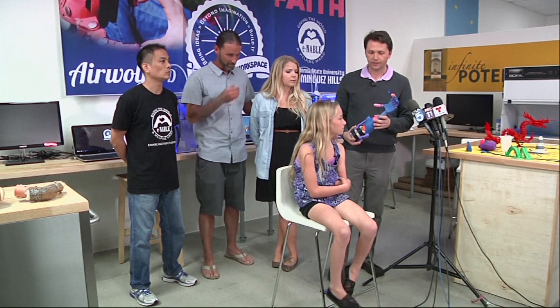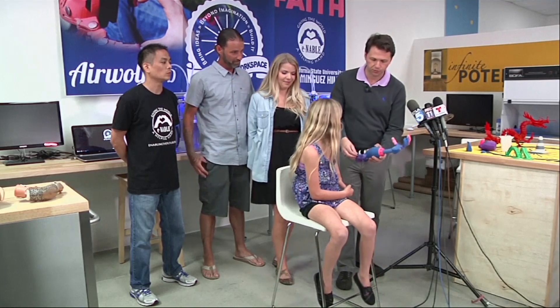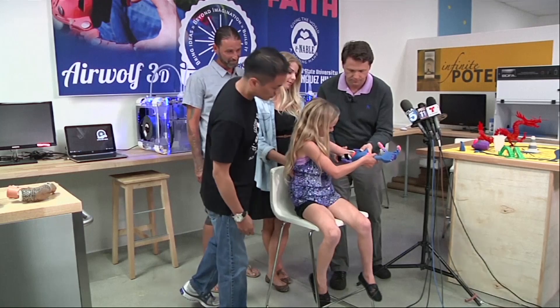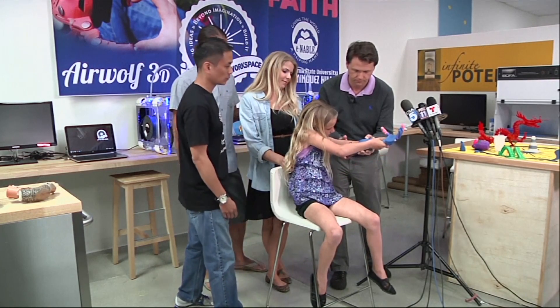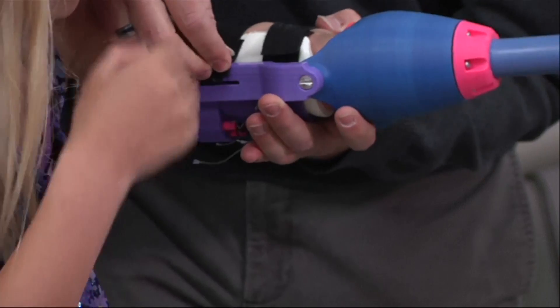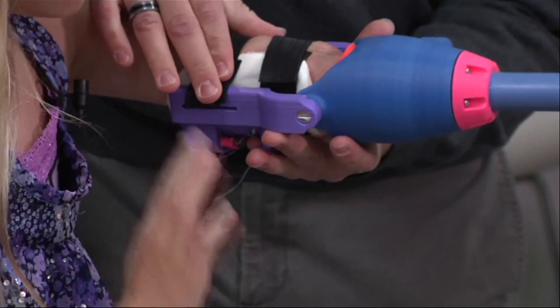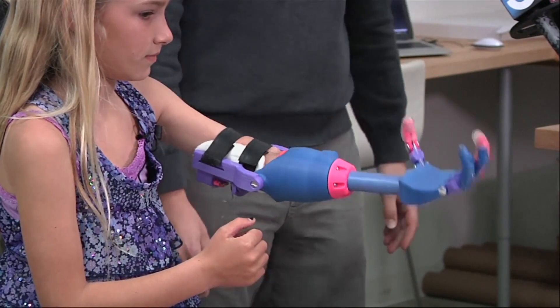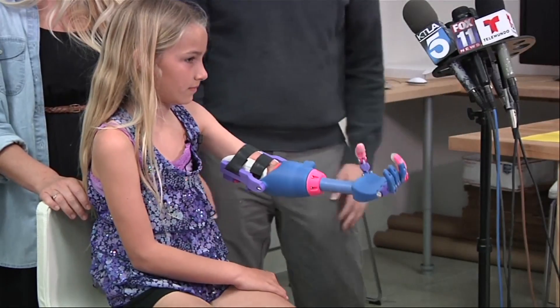Faith, this is the arm right here, so let's put it on for you. And this was entirely 3D printed. Give it a flex. Good job.